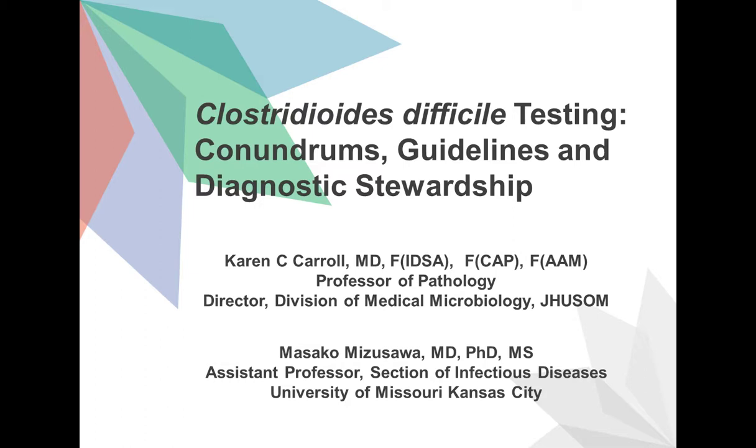So I'm presuming you're talking about the enteric pathogen panel tests or GI panel tests that include C. difficile. Since the laboratory really cannot make an assessment about clinical relevance in those scenarios, I really feel like there should be some discussion with the clinicians about the appropriate use of the panel tests that do include C. difficile. I know that some institutions who have embraced the broad-based GI panels have elected not to report the C. diff and really offer C. diff testing independent of the GI panel. So I think it's difficult for me to answer the question directly without knowing the clinical circumstances surrounding how the testing is performed in that particular laboratory.